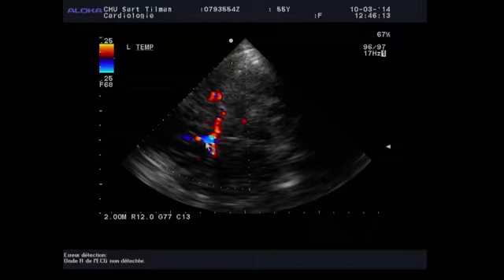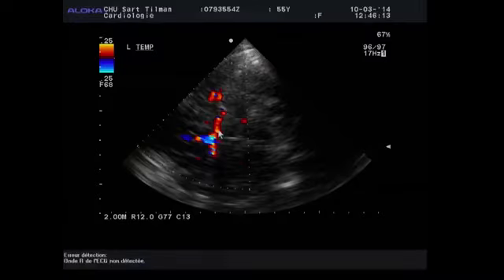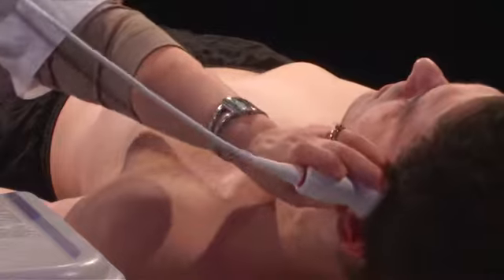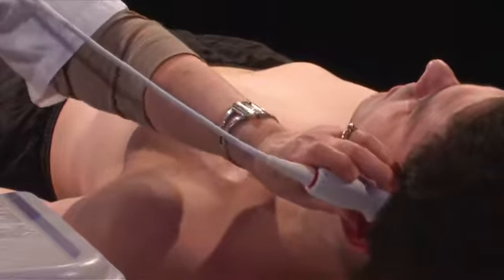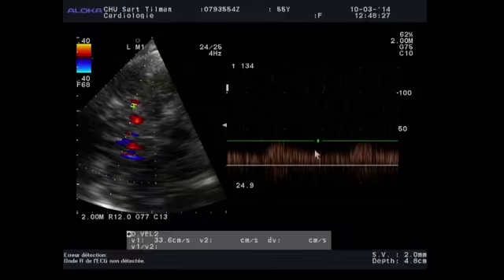And here you have the cerebral arteries, the middle cerebral arteries here, the anterior arteries here, with high velocity and this blood flow is in abnormal direction because it gives blood to the other part. And here on the other side, you have a damped signal here.